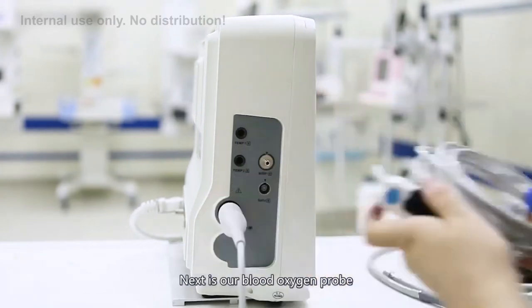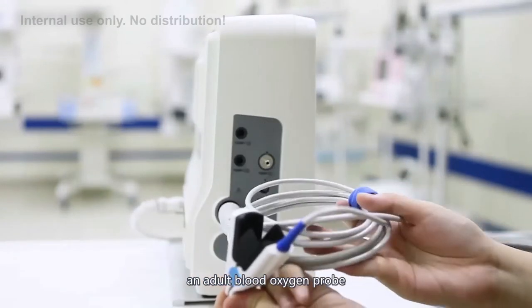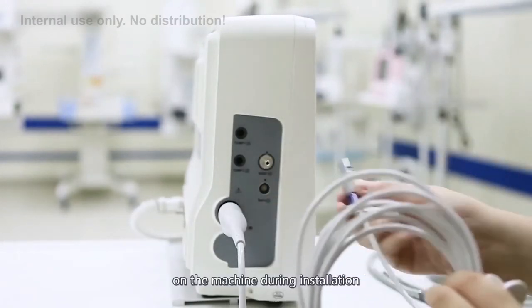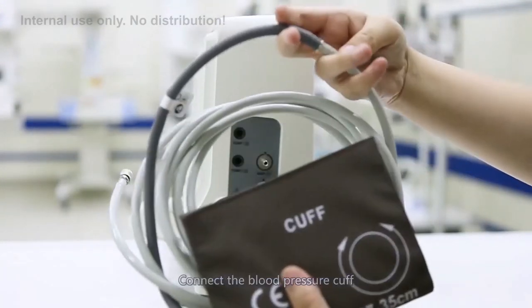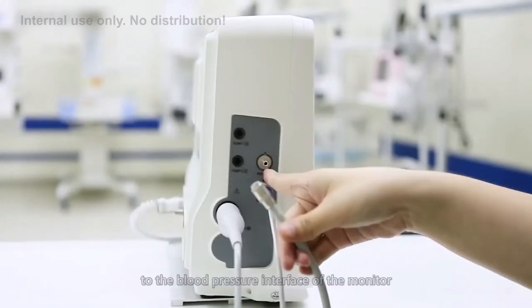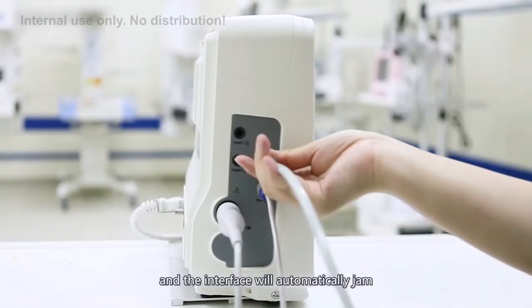Next is our blood oxygen probe. Our standard configuration is an adult blood oxygen probe. The interface has a slot, which is aligned with the notch on the machine during installation. The last accessory is the blood pressure cuff. Connect the blood pressure cuff to the blood pressure extension tube, and the extension tube connects to the blood pressure interface of the monitor — the interface will automatically lock in place.